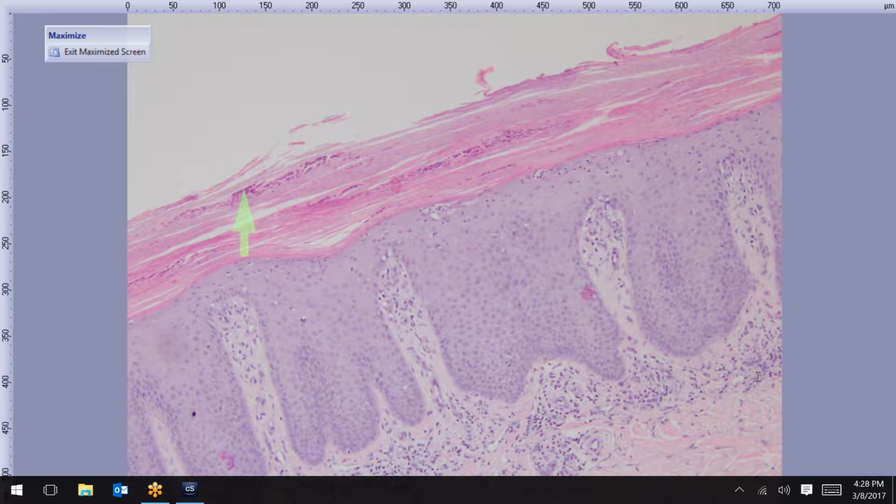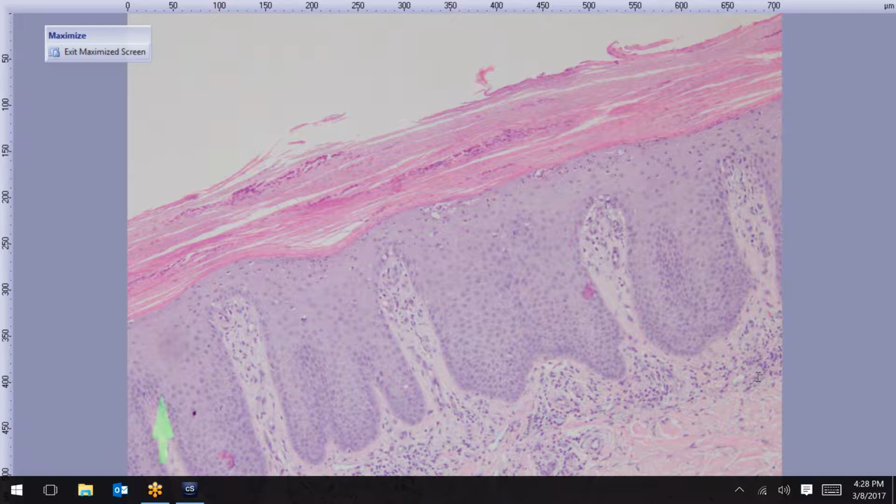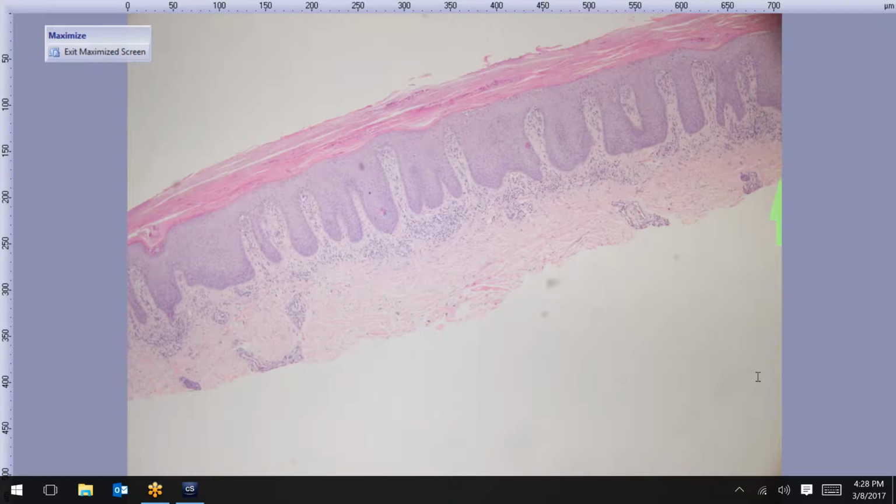Next, I'd not make it so regular, because pityriasis rubra pilaris really is an irregular acanthosis, and rather than these thin psoriasiform features, they're more bulbous, a broad-based acanthosis that goes down like that. And those would be some of the features if we wanted to turn it into PRP.